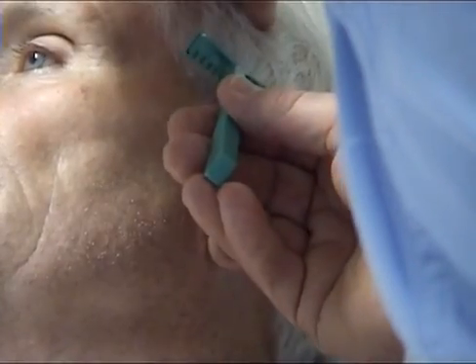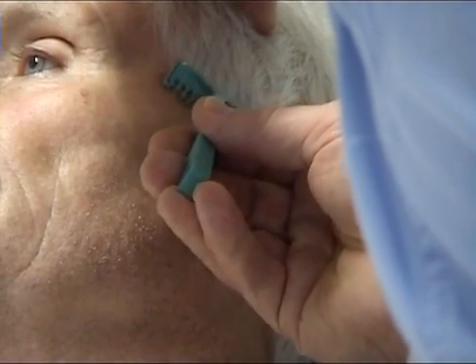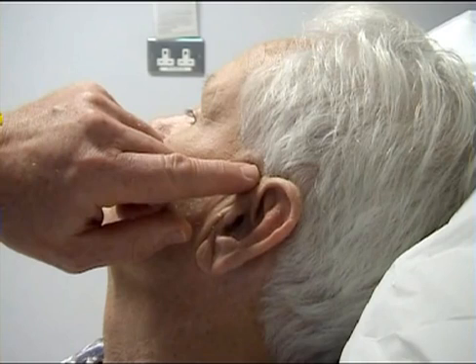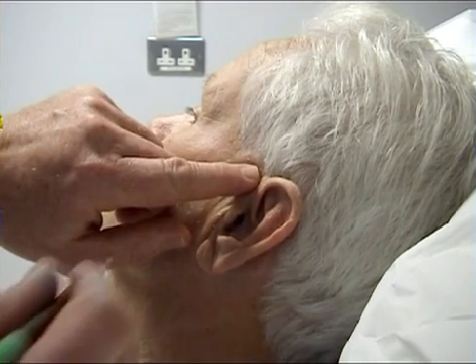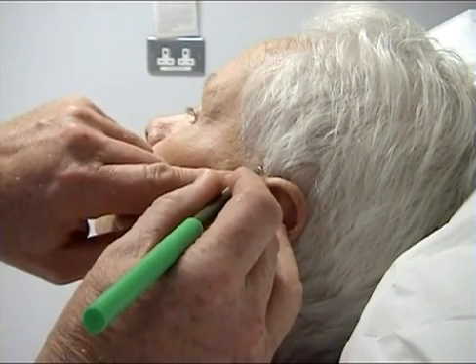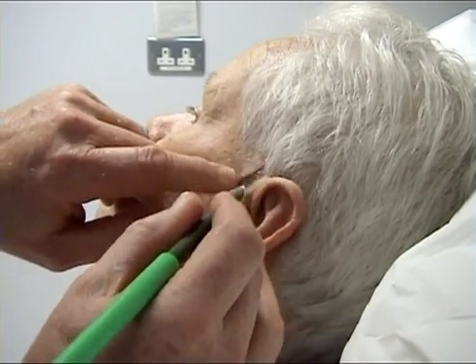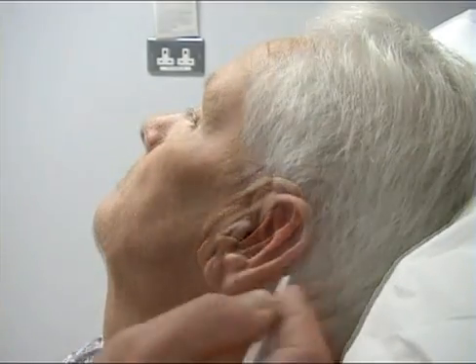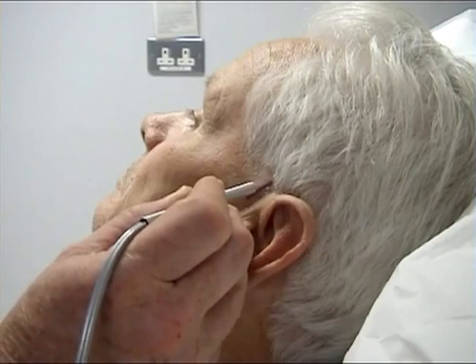The area in front of the upper ear is prepared and shaved as necessary. The artery itself can usually be located by palpation, at which point the skin is marked. The artery may also be confirmed with Doppler.